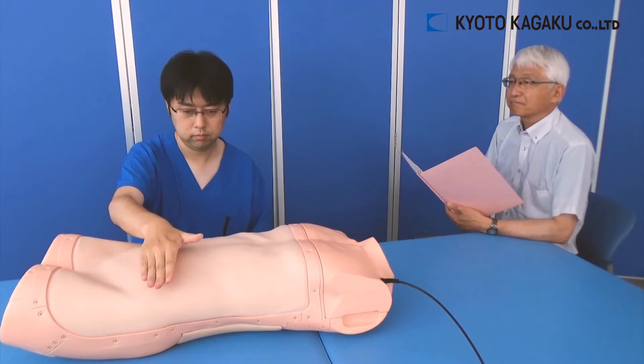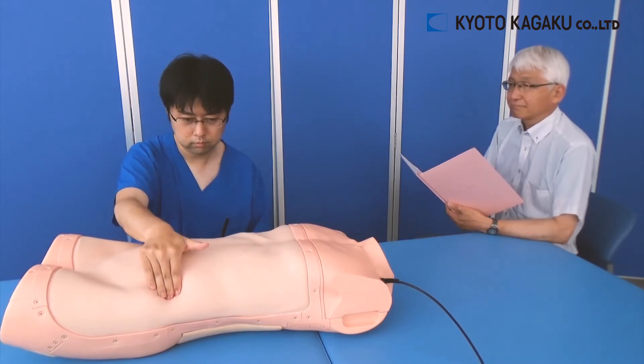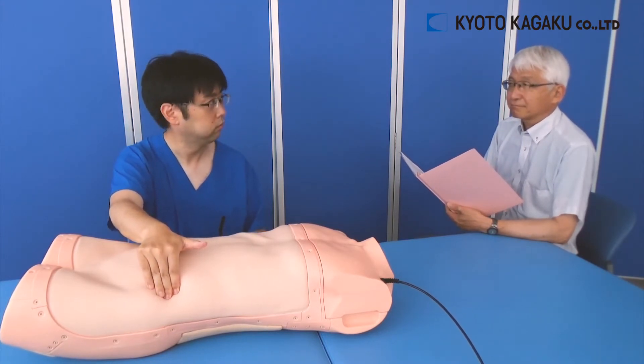You are looking at the Abdominal Examination Simulator, Abdo Abbey, from Kyoto Kagaku.